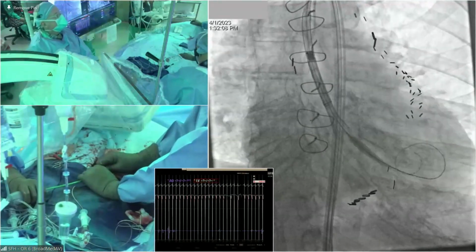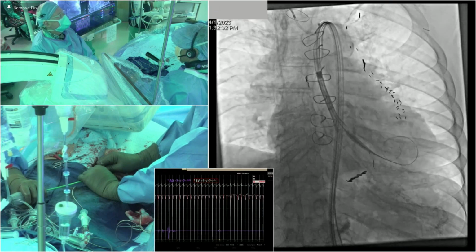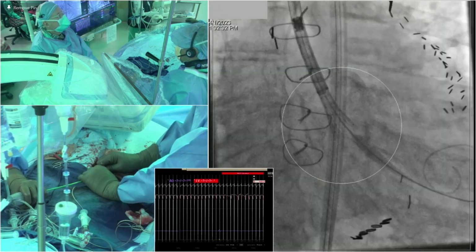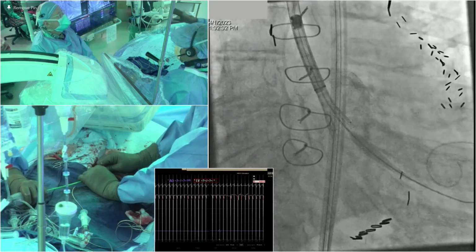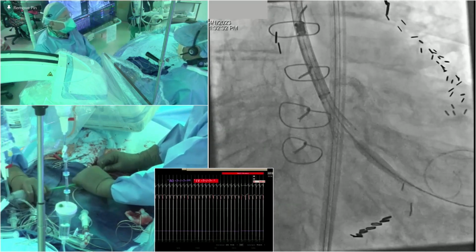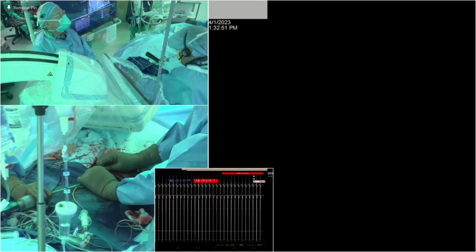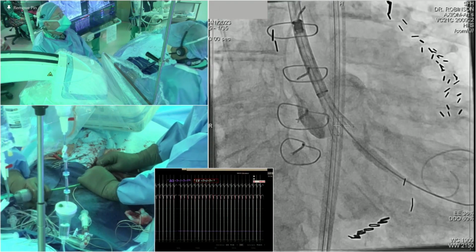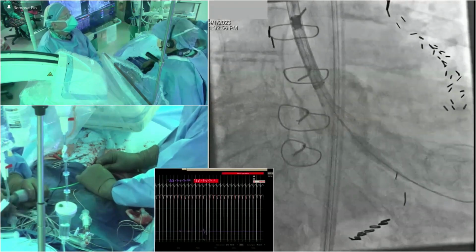George, yeah. So the nice thing about the FX is you've got these 3 dot markers on the valve. As George and Newell unsheath, you want to keep those dot markers at the annulus. And it looks good right now. It looks very good. So we're going to do a quick shot here. That's great. Yeah, maybe you'll come back a little bit. Okay.